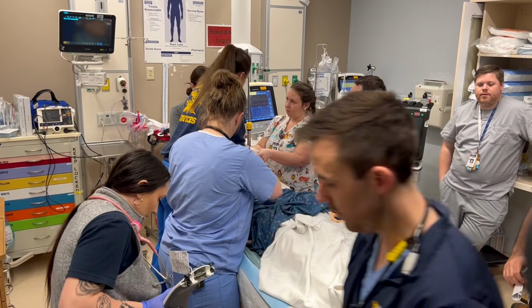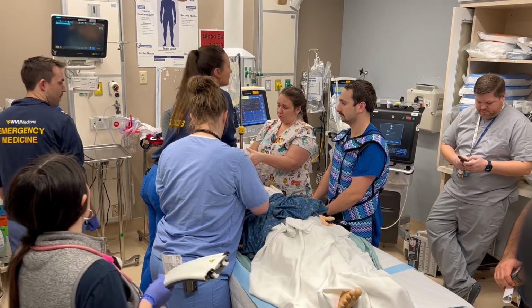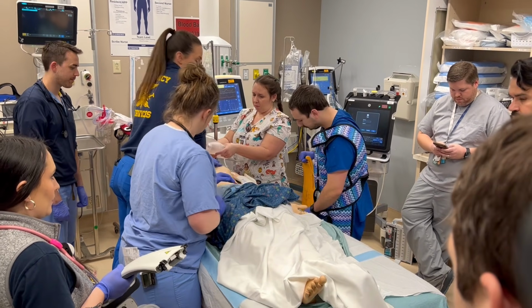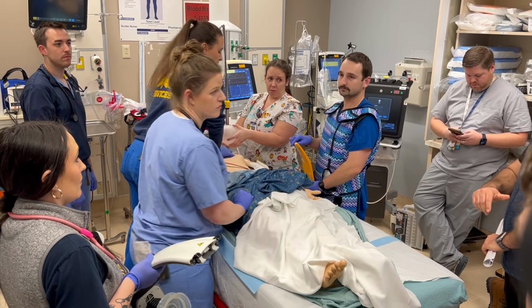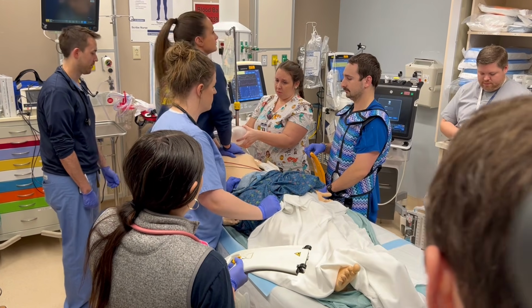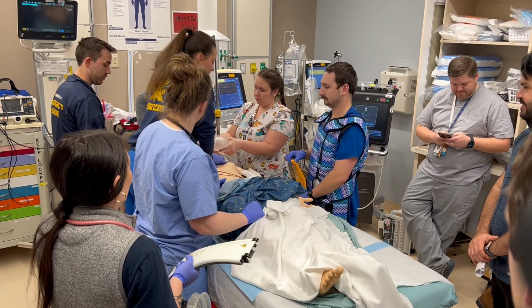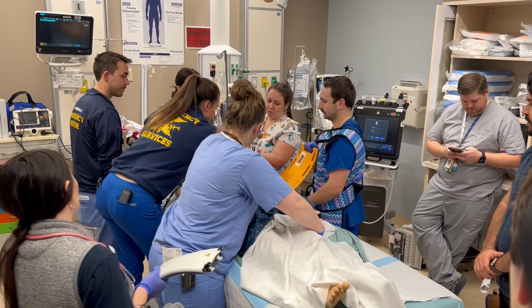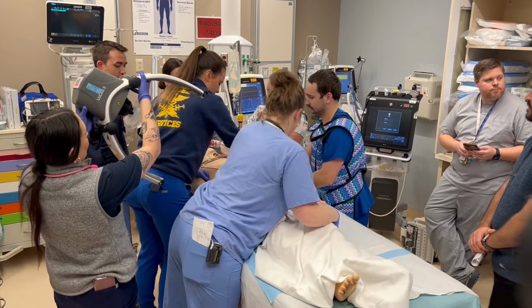So with the next pulse check, we're going to roll him. He's going to put the board under him and then we'll attach the Lucas. And you will go with us for disconnecting the Lucas? Yeah, we can do that. There will be someone, we don't operate that. Okay, are we ready? I don't want to delay getting back now. 1, 2, 3. Board's under? Let's do the first check.